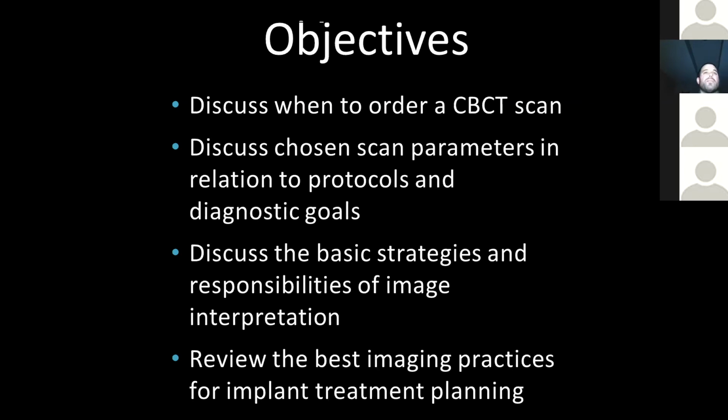I'm aware of a couple that will go all the way from a small 5 centimeter cylinder all the way up to a large field of view. The majority of units typically don't. There's some small specific ones out there, and then some combo, a small and a medium, and then large. So there's kind of a division right in the middle. My best recommendation is if you're looking for a unit that will do a number of different fields of view, get online and try and find some, but also speak to other practitioners in your region and see what they have and what they like.